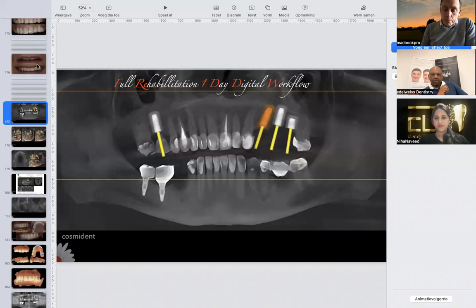You have to check your patient's occlusion spots on a regular basis. If you see that he has too-high occlusion spots on some parts, with the Edelweiss blocks it's very easy to take away this over-occlusion and polish it simply, and it's still the same material. If you do this with zirconium and you grind on the zirconium, you destroy your zirconium structure. That's the problem.